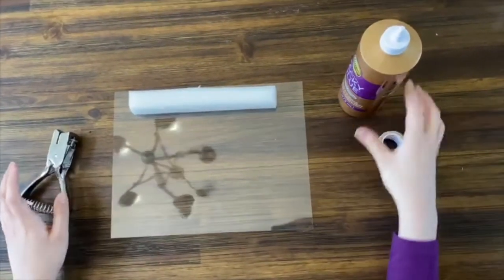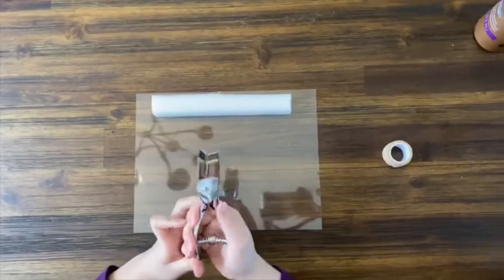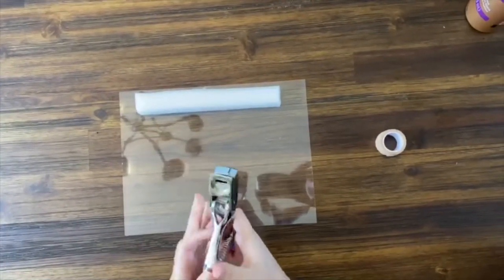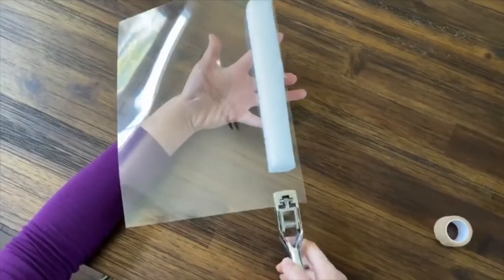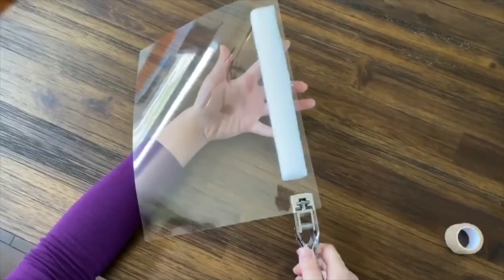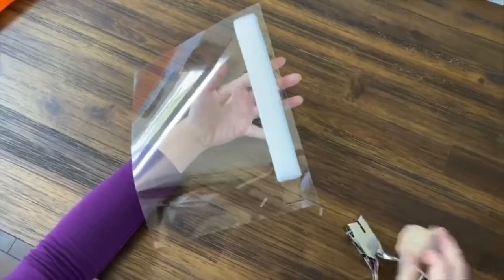So the next thing you're going to do after gluing it is let it dry overnight, and once that's done drying, you're going to use a hole puncher. This is a weird hole puncher. As you can see, it cuts out little almost rectangular shapes, which is great for the cohesive bandage, but if you don't have this or you don't want to get it, you can always use a regular hole puncher as long as you make the shapes similar. Okay, so you're going to take the hole puncher and put it next to where the foam is, but as far away from the edge as you can make it, just so it won't break as easily. And then you're just going to punch it about twice with this one, just so it's long enough to fit the bandage.